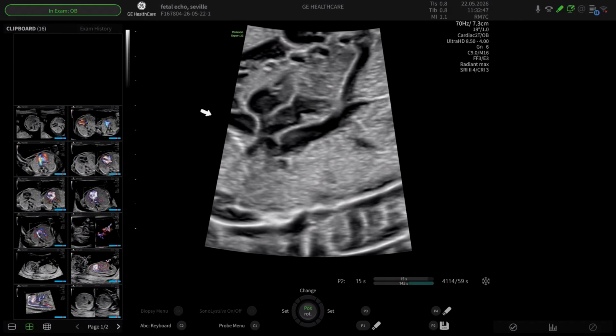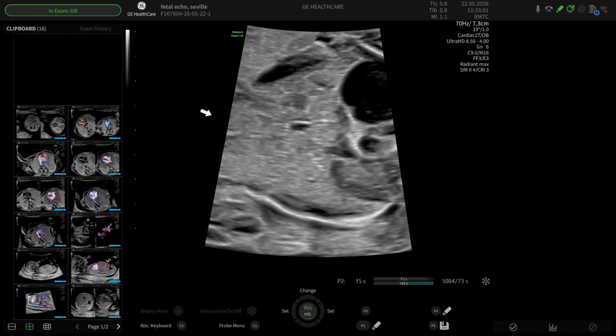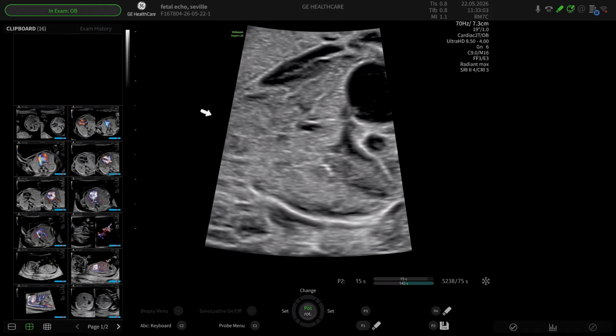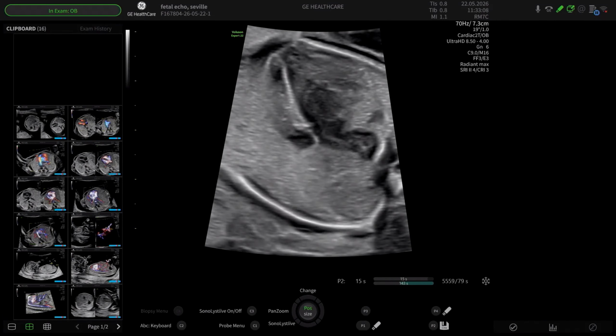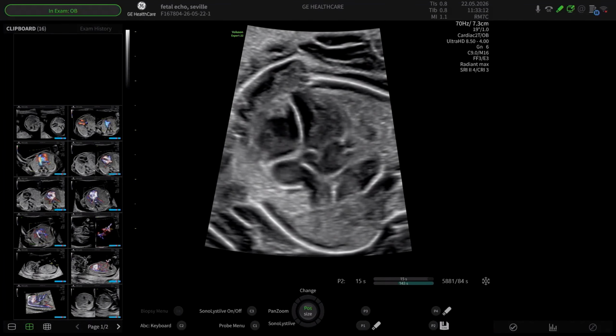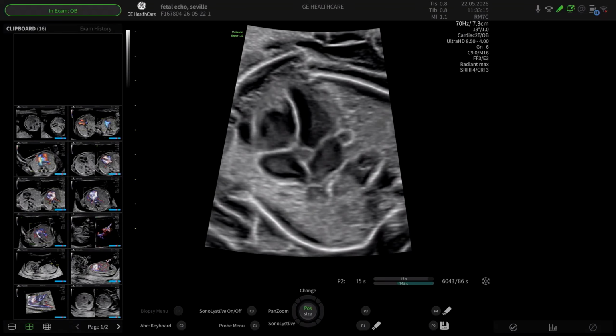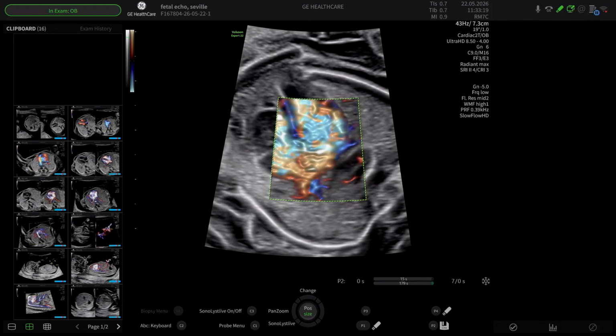Simon, we have a question: how can we see the four pulmonary veins, not only the inferior ones, but also the superior ones? Yeah, in 2D imaging, that's extremely difficult. The only person in the world who can do that is Reem Abu Rustam, who showed a beautiful example in her picture of the pulmonary veins. She made the point that you have to choose a slightly oblique view. In terms of bringing in all four, it's very, very difficult on standard imaging.